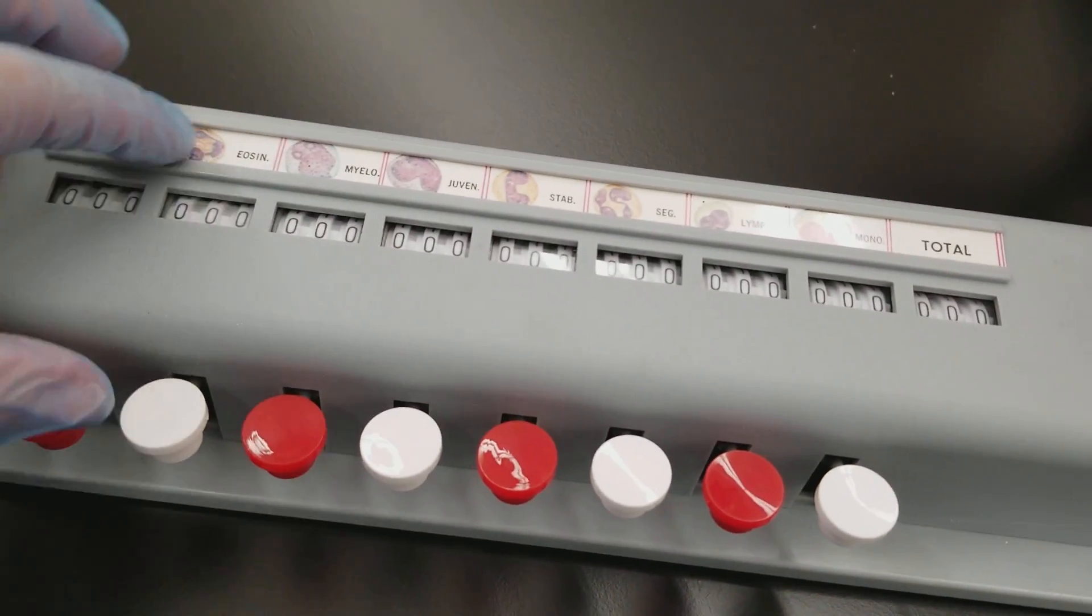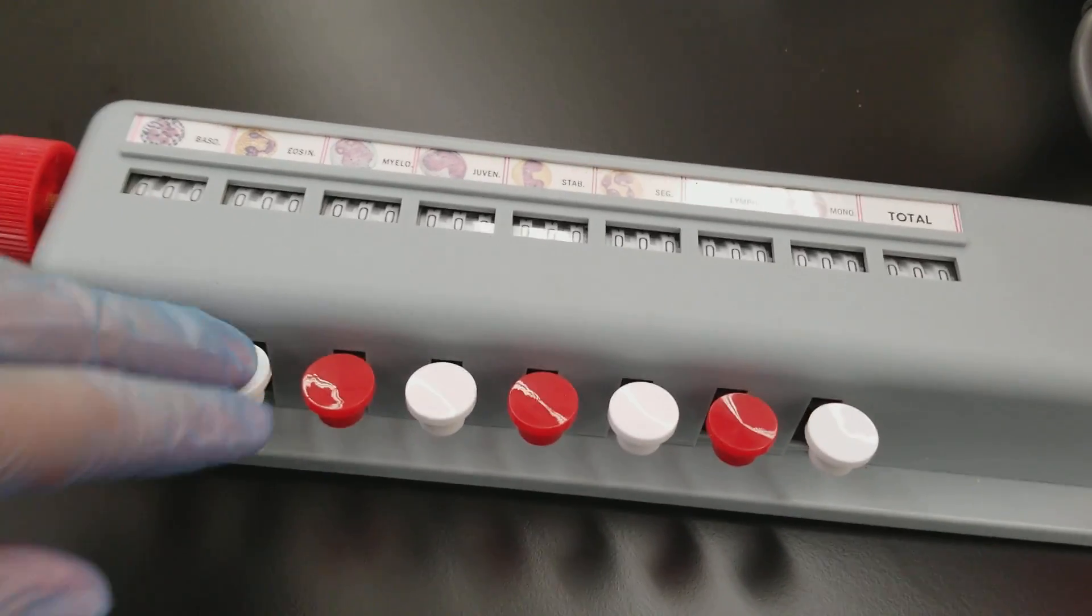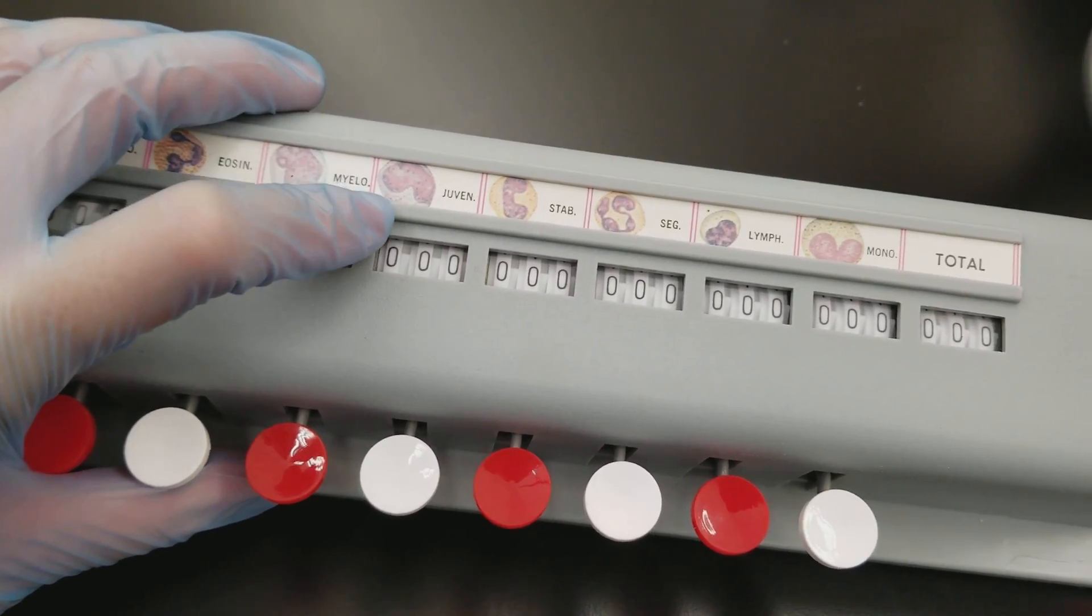You don't have as many eosinophils and basophils. So that's why they're out at the end. You don't usually have a lot of immature whites either.